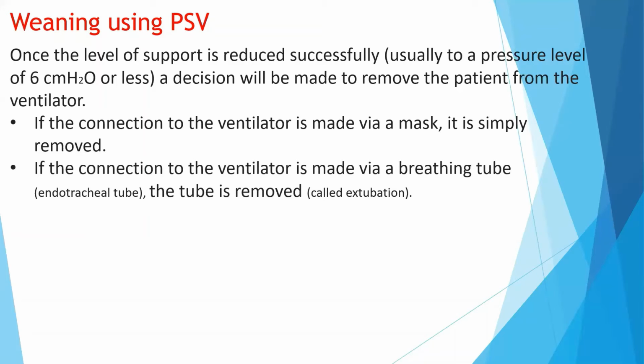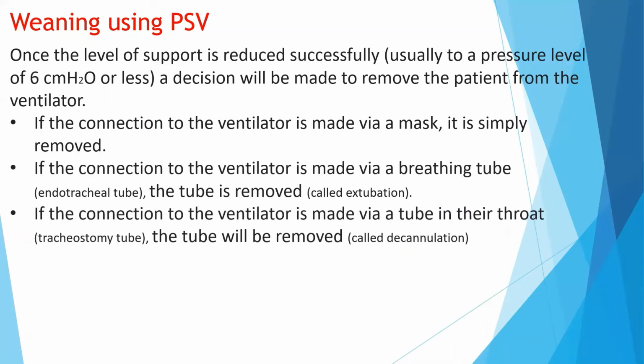This is called extubation. If the connection to the ventilator is made via a tube in their throat, a tracheostomy tube, the tube will be removed. This is called decannulation.